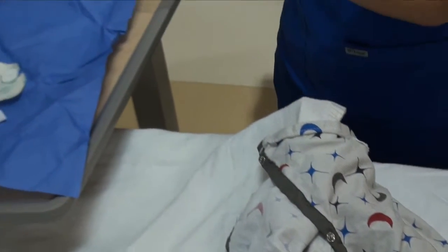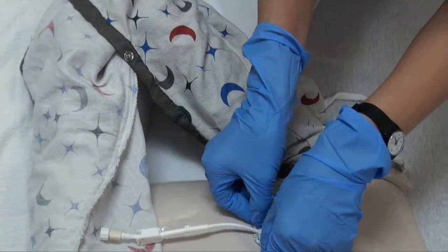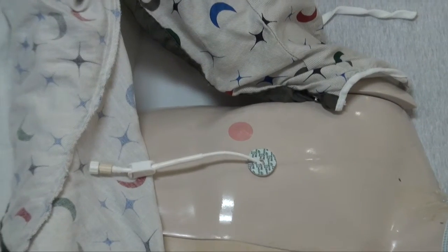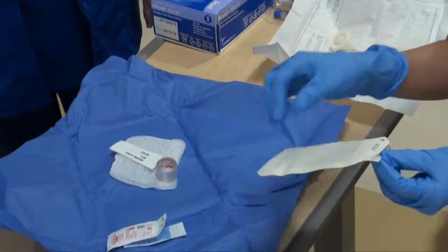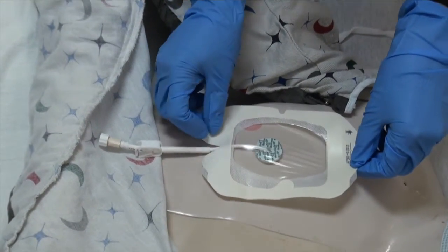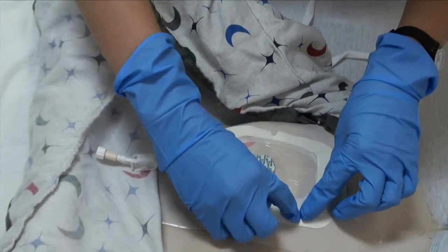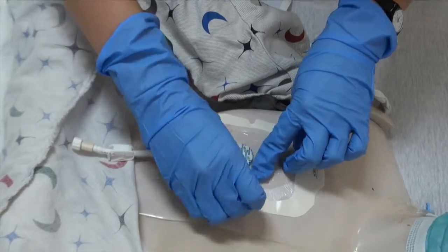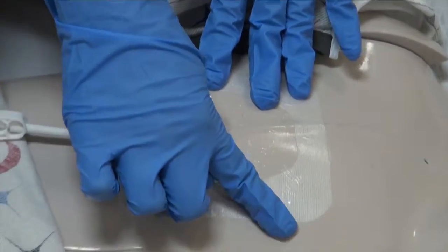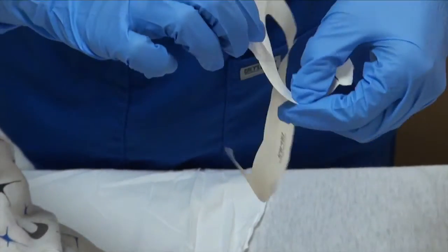Apply BioPatch over the insertion site with the blue side up. Once in place, you will apply the transparent dressing. Ensure that all edges are down and apply the small piece of tape, ensuring a complete seal on the line.